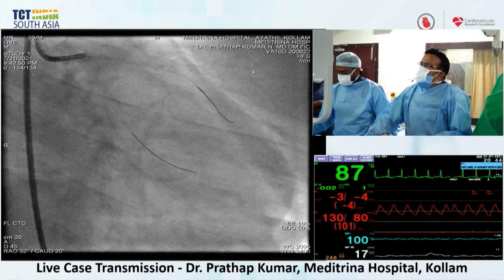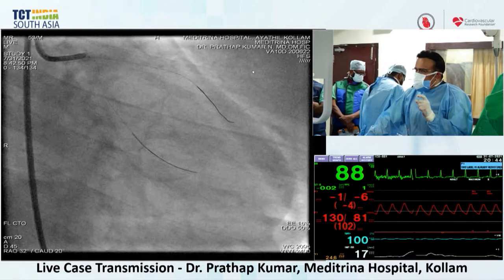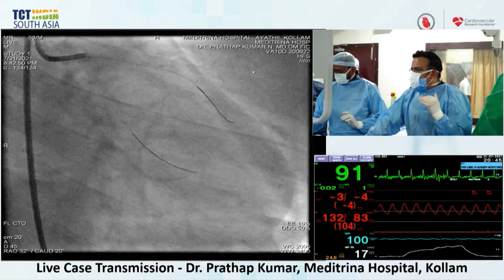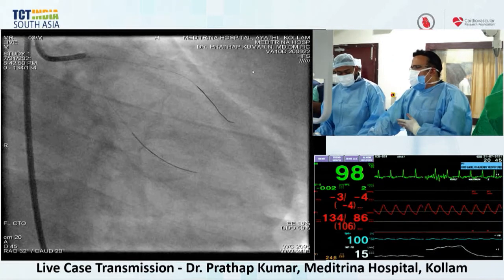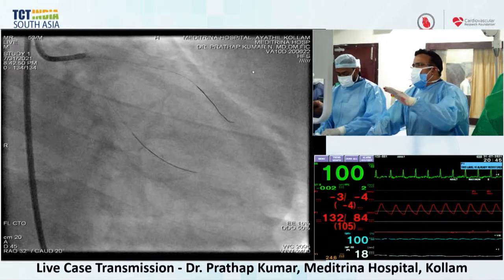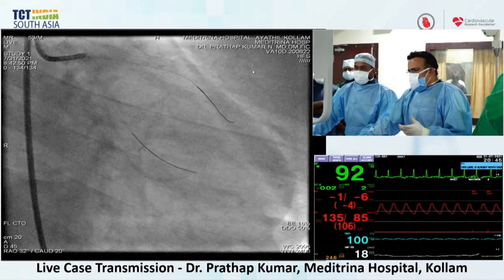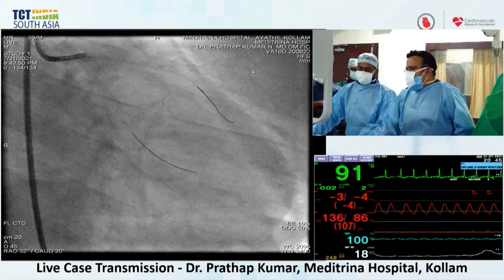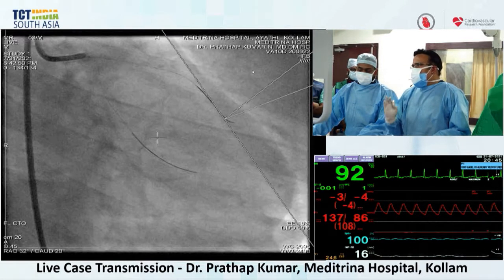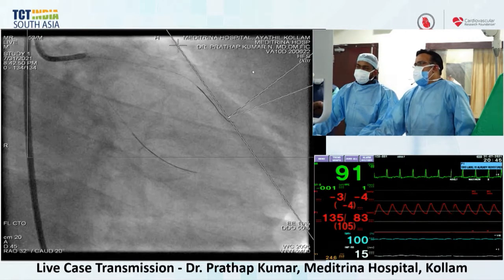Dimitri, the only point I wanted to stress is if you have a vessel lumen which is underfilled distal to the entry of the septal collaterals, then you require a wire to go to the antegrade. Otherwise, if the septal collateral was distal and the vessel disease was totally in the proximal part of the collateral, that is RG3, then we usually finish with one wire and we don't take another wire here. And naturally in this case we definitely require a wire into the circumflex. Do you agree with that? Correct?